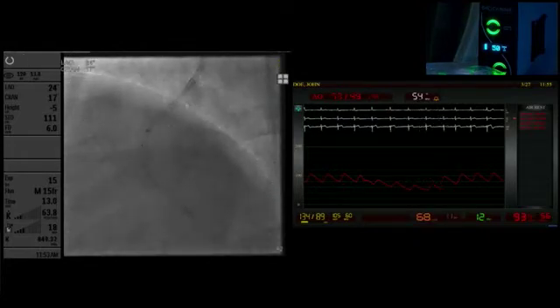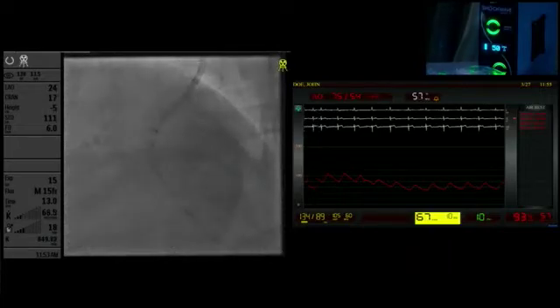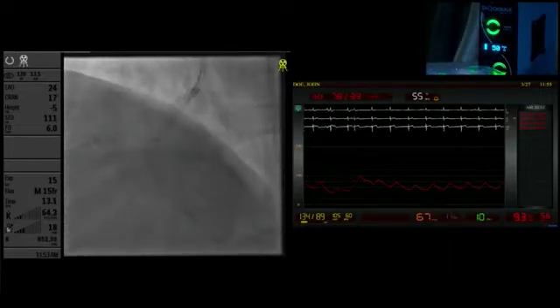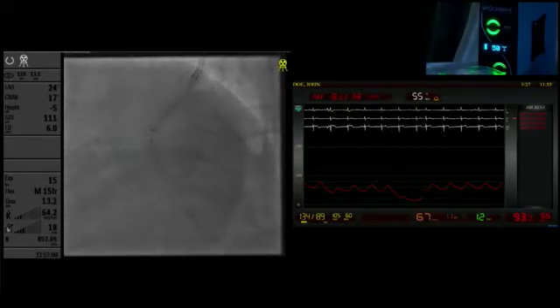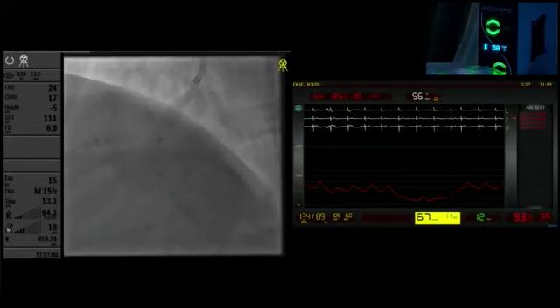So I have half a catheter left. I have 4 more treatments. Do as much as you can. We have only 3? Come a bit more proximal. Are you ready to do it again? Yeah, go ahead. Yes, there we are.